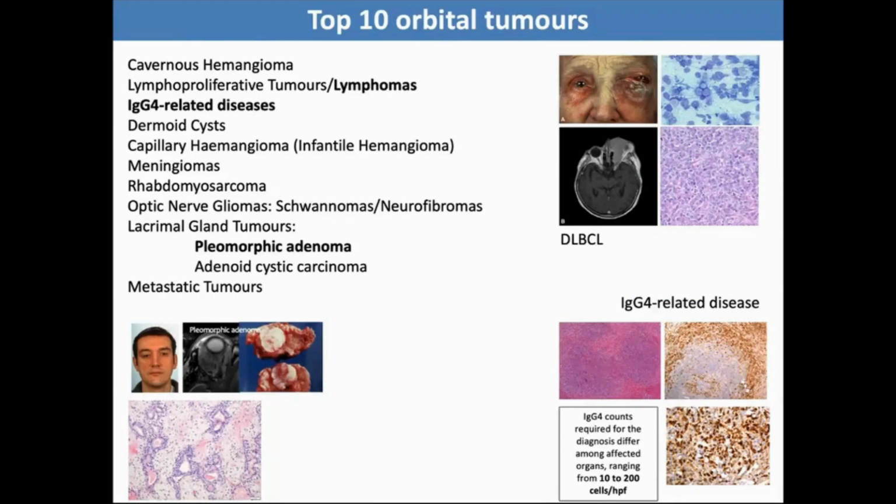Then I'm going to move to some of the other lesions which occur in the eye and in the orbit, and they include the most common tumor arising in the lacrimal gland, which is the pleomorphic adenoma. And I'm sure you've seen examples of these. They show a variety of components, with the epithelial components and also the stromal components, and one may be dominant over the other. They are typically well circumscribed and can be removed in sano by the surgeons.